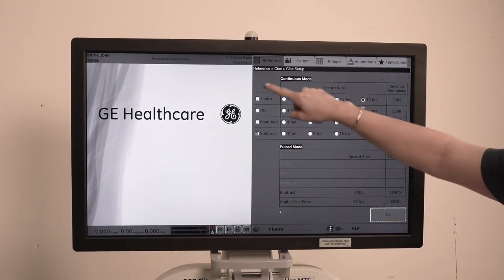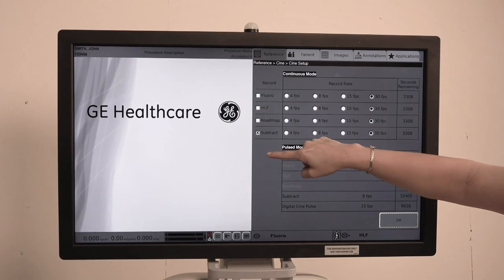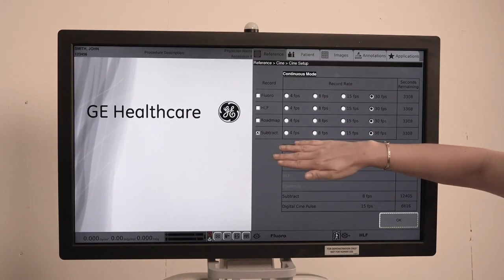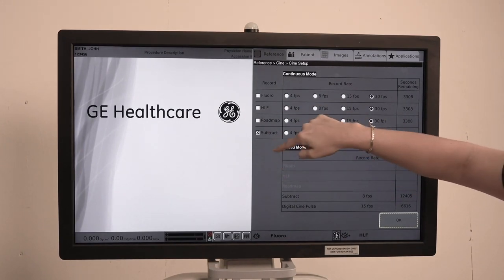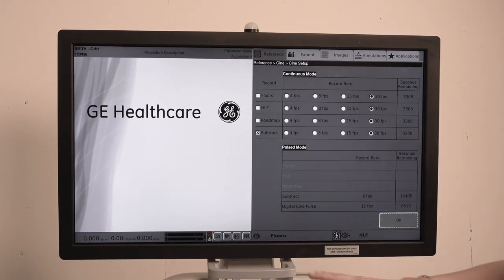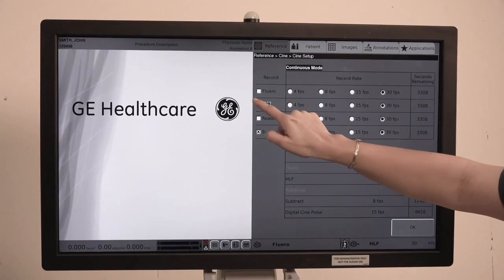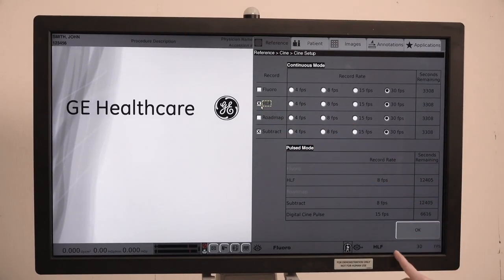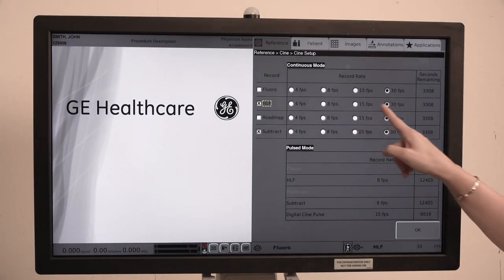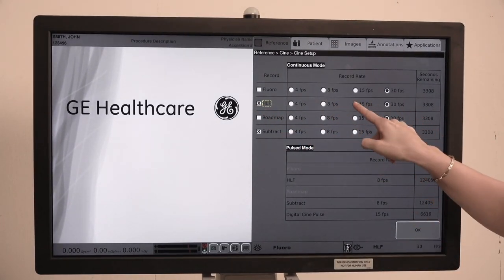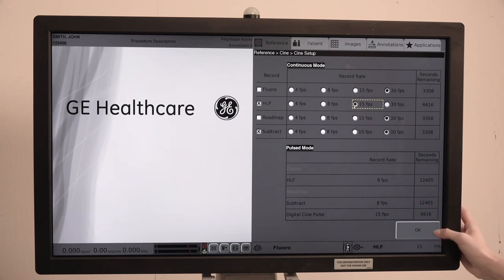And then whatever you want to record, whichever mode, you'll just put an X in the box. So we'll say that we're going to record high-level fluoro. So I'll put an X in the box for high-level fluoro and then you can change your frame rate as well.